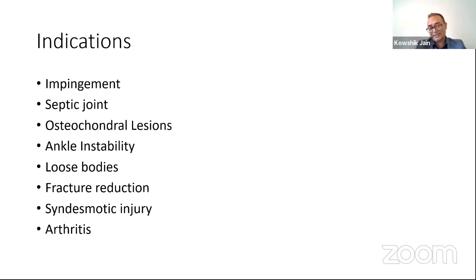So this is a technique which I think will gain more popularity over the years, and may become the norm down the line. Loose bodies, as you all know, it's again a very satisfying procedure, doing a scope and taking a cartilaginous or an osteocartilaginous loose body out.